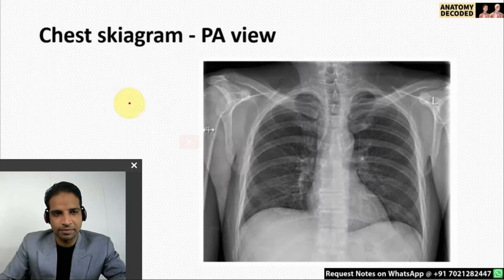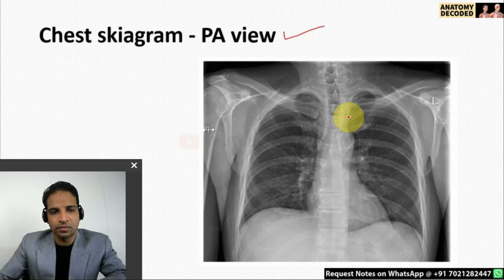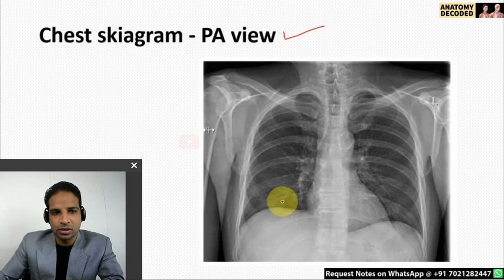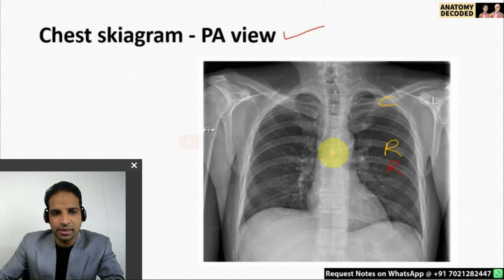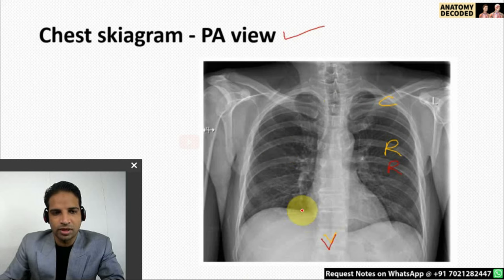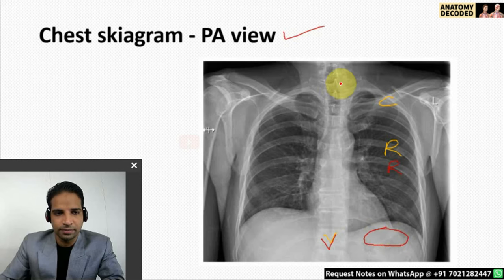Let us cover the chest skygram in detail. This is the chest skygram, posterior-anterior view. The ribs are visible, the clavicle bone is visible, and in the midline the bodies of the vertebrae are visible. Soft tissue shadow of the heart is visible, and air shadows of the lungs. Air shadow of the air in the fundus of the stomach is also visible, as is the air shadow of the trachea.